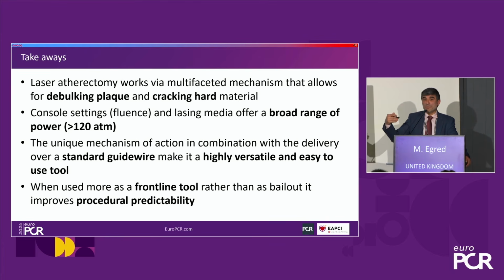We are treating more and more elderly patients with calcified, difficult arteries. We are seeing a lot of unstable angina, an unstable patient where you haven't seen the anatomy. You put your wire through and you end up having to struggle to cross the lesion or to dilate it, and that's where laser could come very handy.